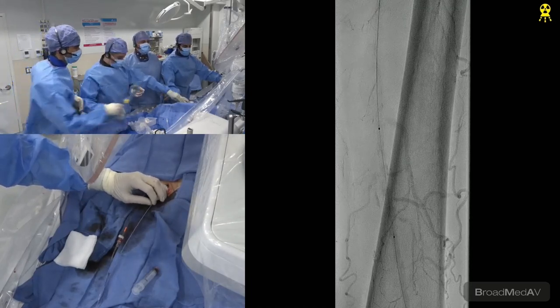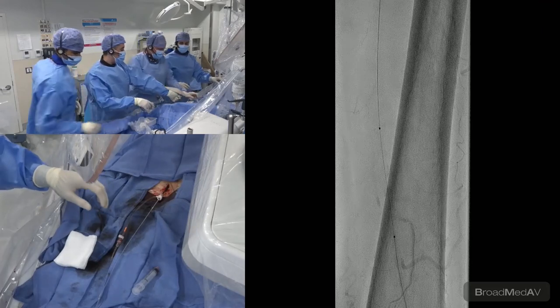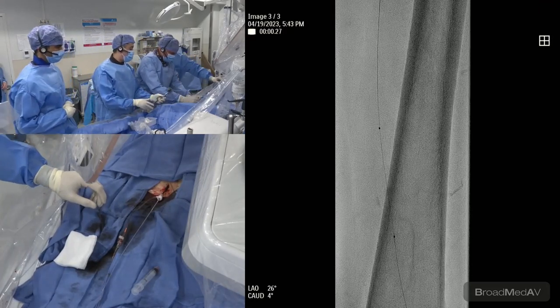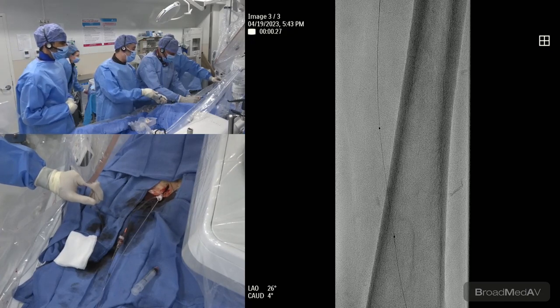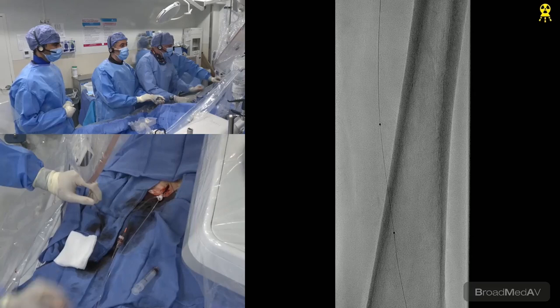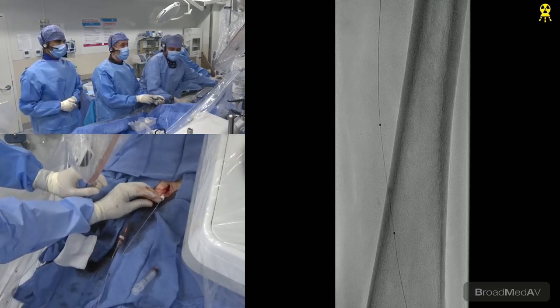No matter what vessel size you think you're going for, right? Yeah, whatever. Let's say you're going for a 5.5 Supera or a 6.0 Supera. Your predilatation balloon should be nearly 1 millimeter bigger.